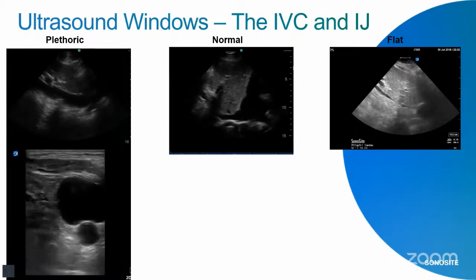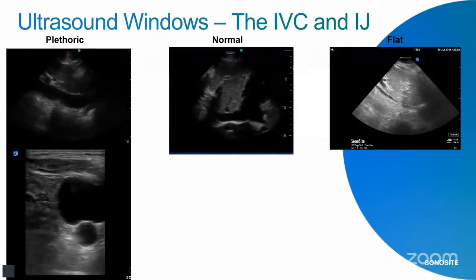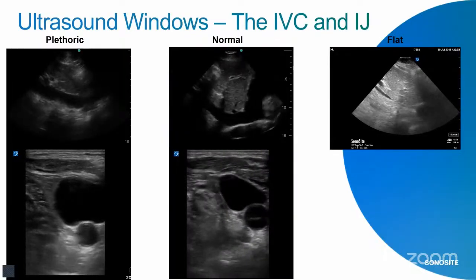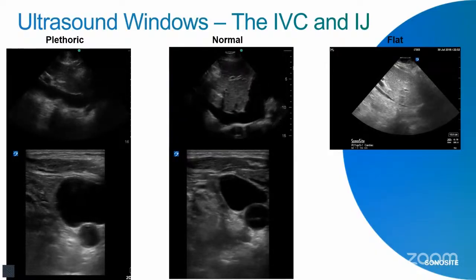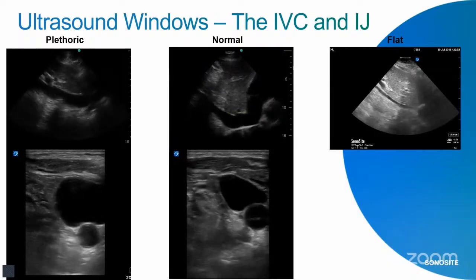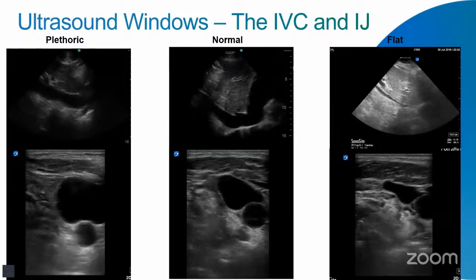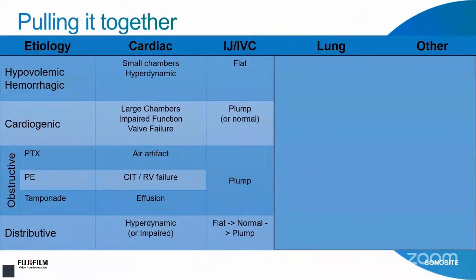we have a correlating internal jugular pattern where high on the neck, you can see here a dilated IJ, much bigger than the carotid, not changing with respiratory variation. Here you can see a normal IJ, where even just above the clavicle, you have a triangular, a trapezoidal shape that changes in size with respiration. This represents a normal right atrial pressure. Or here you can see somebody who just above the clavicle has a completely collapsed IJ that only expands during exhalation. So if we put that together into our table, now we've got our third column.